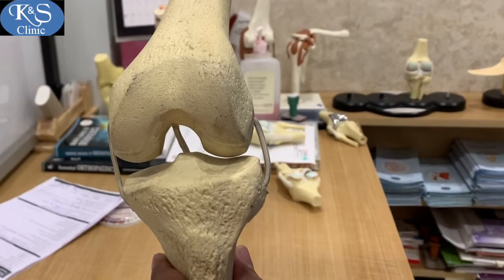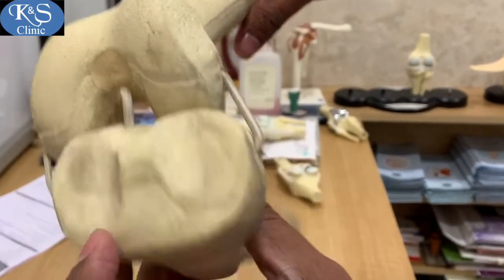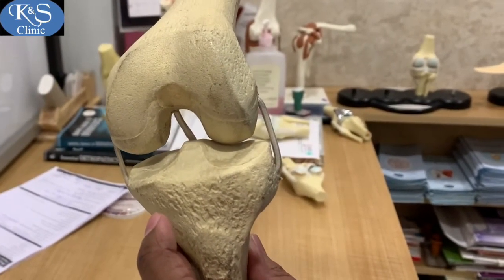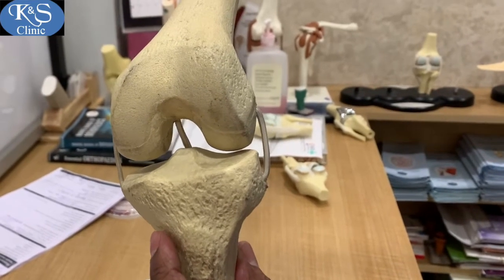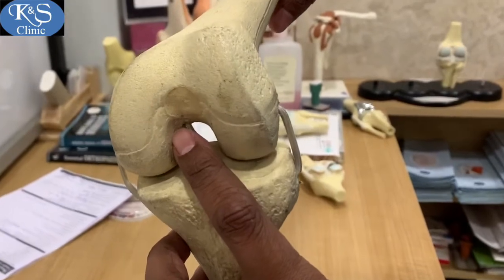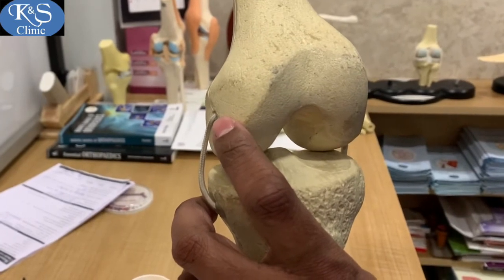The two ethybond loops are delivered through one portal to ultimately make one ethybond loop that exits from the anteromedial aspect of the tibia. This pulls the graft upwards into the femur. The graft is fixed with a tightrope on the medial aspect of the femur and with an interference screw on the tibia.